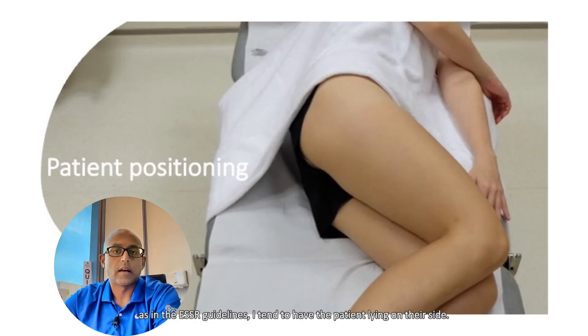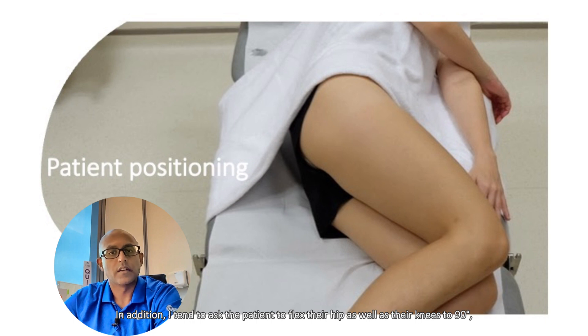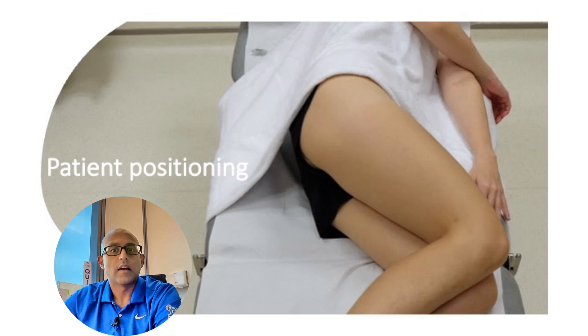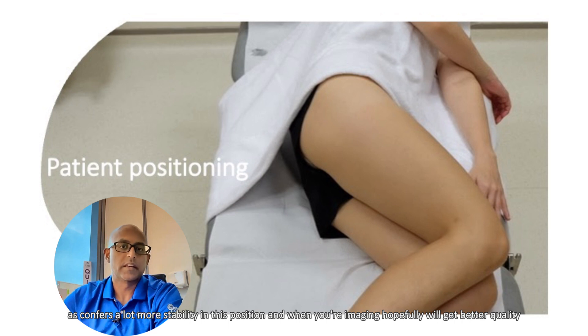In practice, as in the ESSR guidelines, I tend to have the patient lying on their side. In addition, I tend to ask the patient to flex the hip as well as the knees to 90 degrees, as this confers a lot more stability in this position, and when you're imaging, hopefully you will get better quality images as well.